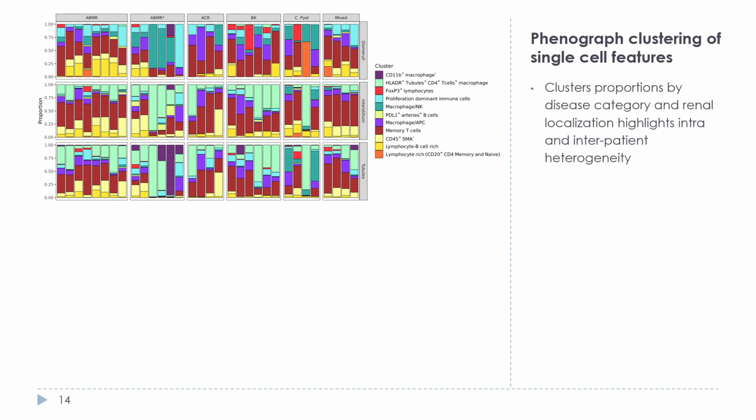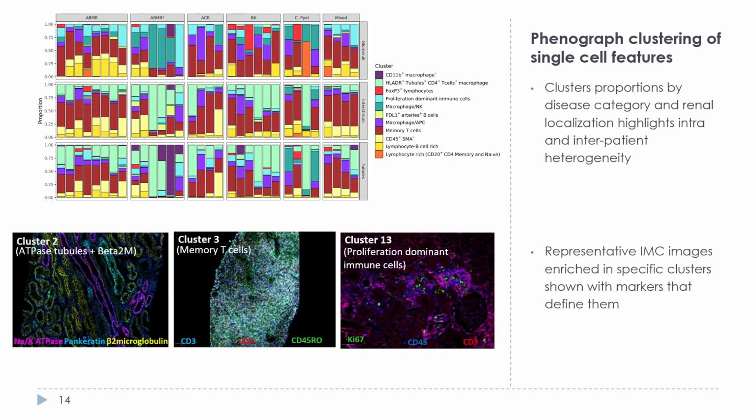So for each renal structure and disease category, the proportions of the most predominant clusters were shown. Each stacked bar corresponds to an individual image, with the height of the segment corresponding to the proportion of that cell type. This is one parallel approach to our percent positive scoring that leverages pathology supervised classifications to score samples for different cell types. We can also query our dataset for the ID of specific images exhibiting high proportions of specific clusters, showing markers differentially expressed in them relative to others.